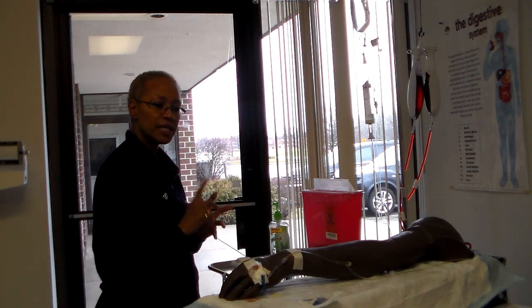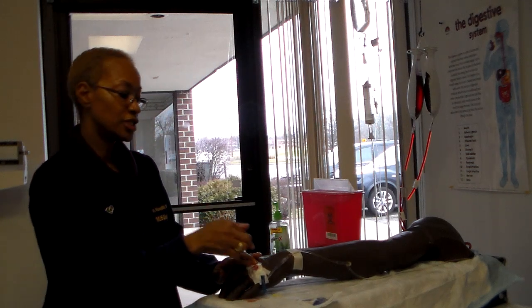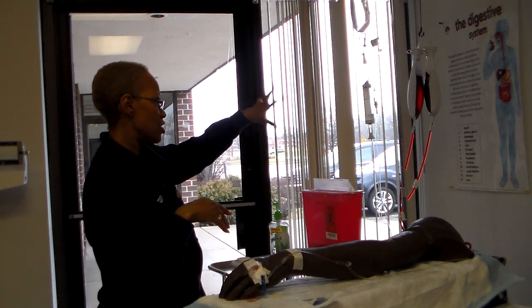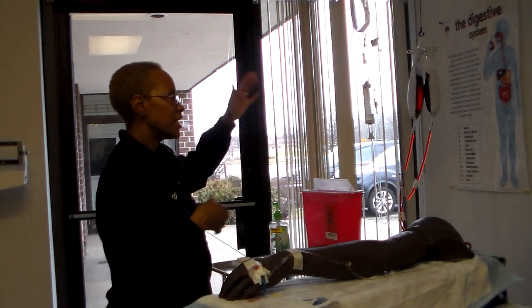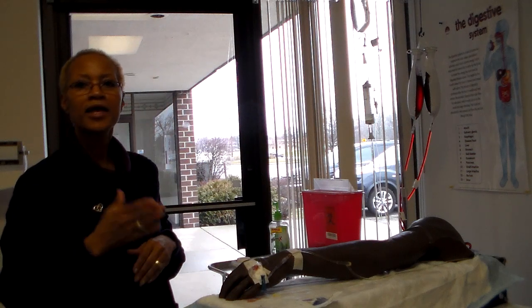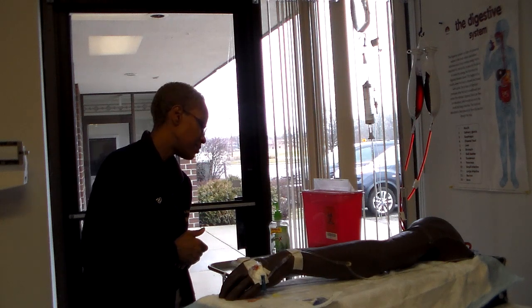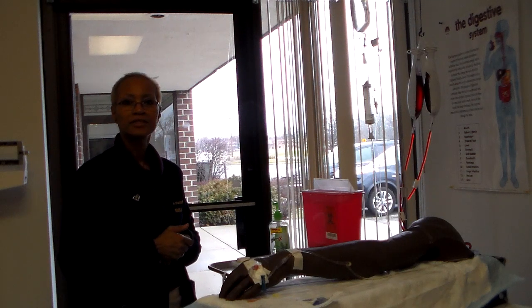And then you're going to make sure that any client you have that has an IV, every 1 to 2 hours, you're going to come in and you're going to check their site. You're going to go all the way back, make sure that there's no kinks in the tubing. You'll check what's in your Buretrol. You'll check your drip rate. You'll make sure everything is fine. When you get down to about 100 left in the bag, you're going to prepare the next bag and have it ready so that whether it's you going back in there or another nurse, that you hang the next bag. Okay, and then evaluate your client's response. That's it.